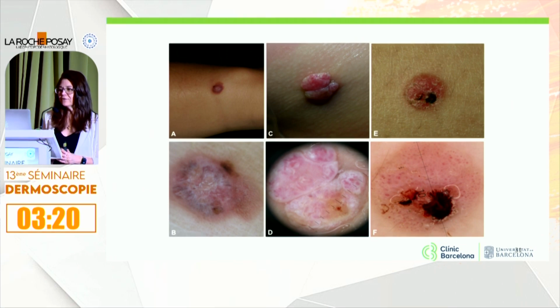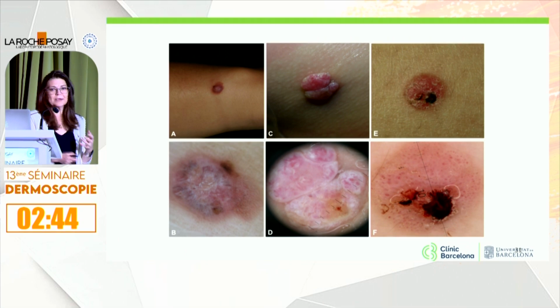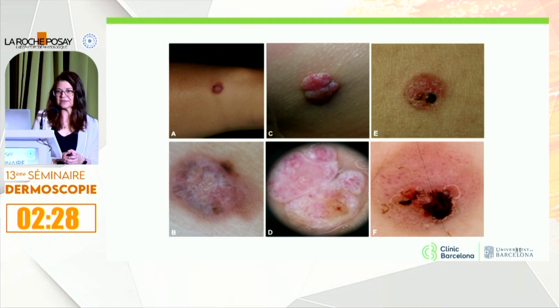But what is more relevant? Spitz melanoma and how they look. Yesterday also we saw them. They are tumors, many times pink tumors, many times fast growing pink tumors, but we can see remnants of pigmentation, then it's a little bit easier to diagnose. But if we do not see these remnants of pigmentation, we need to have in mind that these kinds of melanomas exist. They are similar clinically. You can think of a pyogenic granuloma. But under dermoscopy, you see different things: dotted vessels, atypical vessels, and shiny white streaks. And this is something that usually you do not see in pyogenic granulomas.